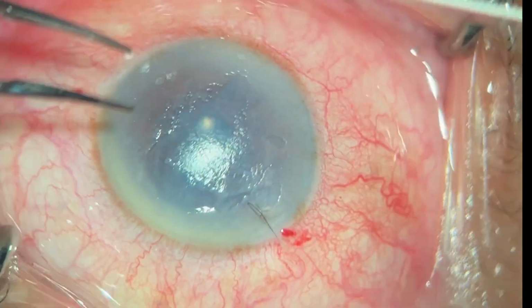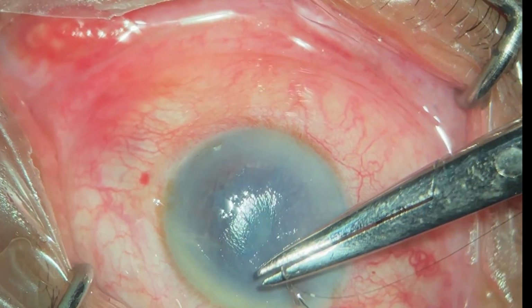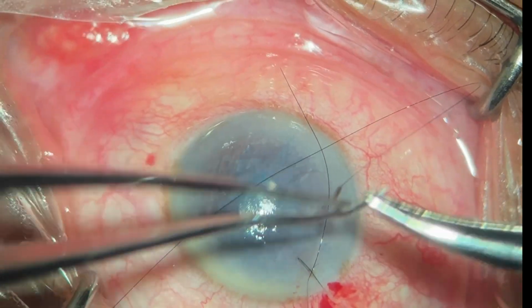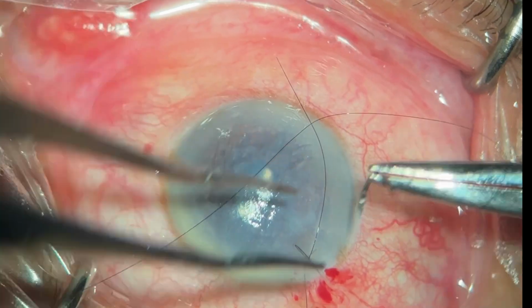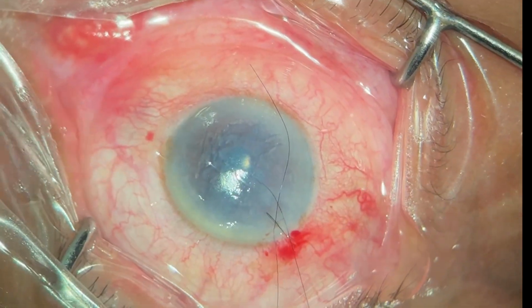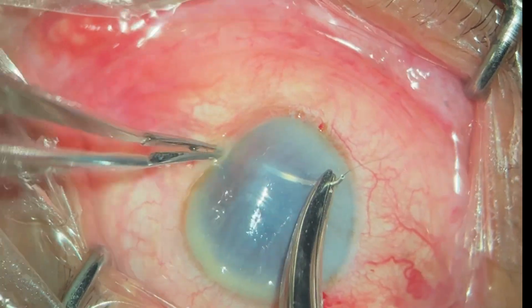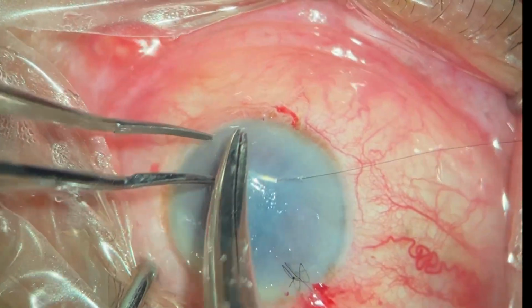I began by debriding the epithelium so that I could visualize the anterior chamber clearly. I placed an X stitch over the main phaco wound because the AC was also shallow and I wanted to secure the wound. As I mentioned previously, our DMD was more central and it was bullous.